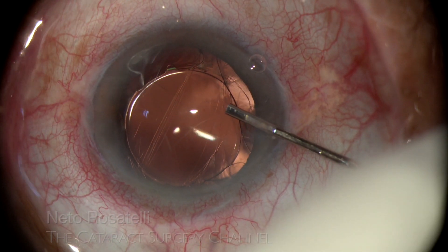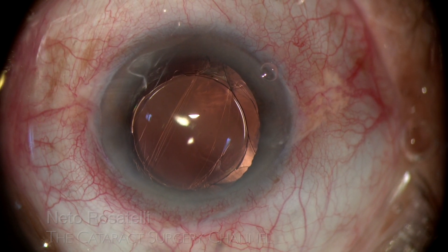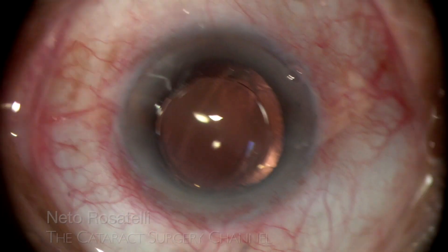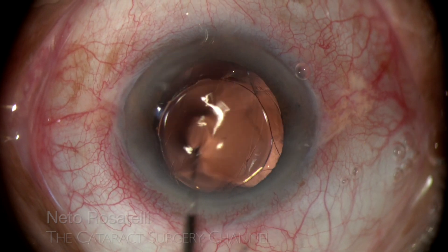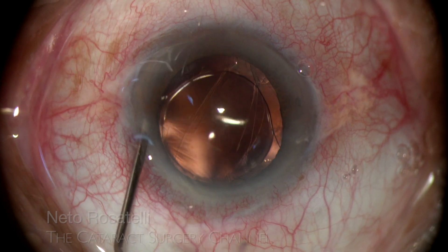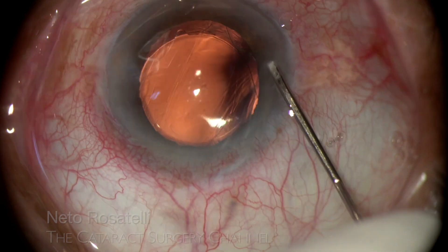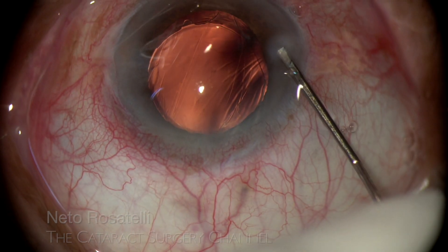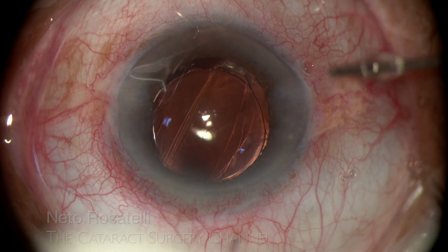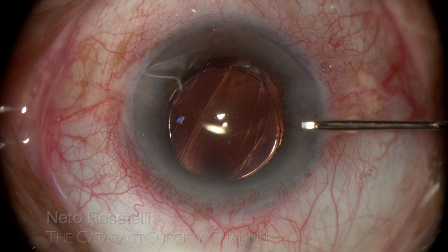Carbacol 0.01% is injected to achieve miosis. It will help to evaluate IOL centration. It's been widely observed that hydrophilic IOLs are well tolerated in the sulcus, especially when secured by optic capturing, contrary to single-piece hydrophobic ones. I begin to hydrate the incisions while I wait for the carbacol to act, as I want a stable and filled anterior chamber to judge IOL position.